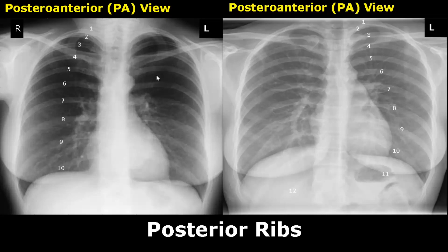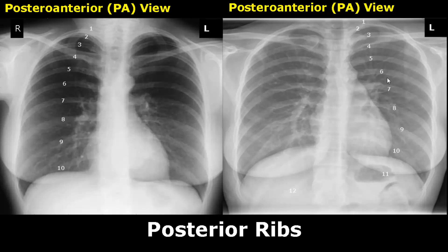We are starting off by looking at the posterior ribs. At least nine pairs of ribs must be seen behind the lung fields. This tells us that adequate inspiration was taken. These are the posterior ribs, having somewhat of a horizontal alignment.